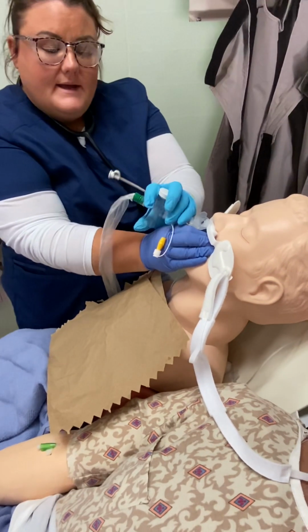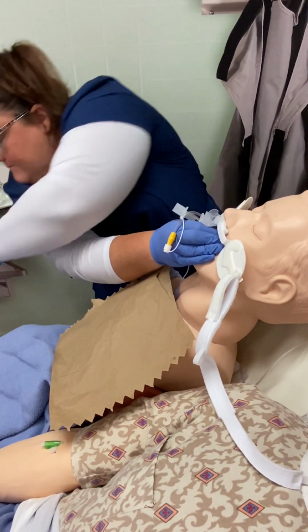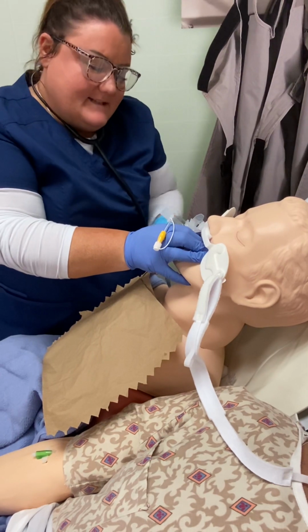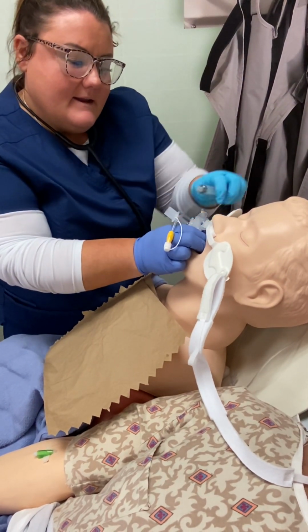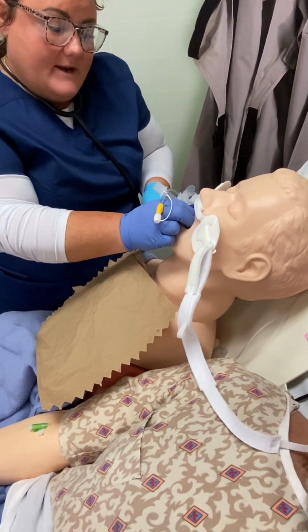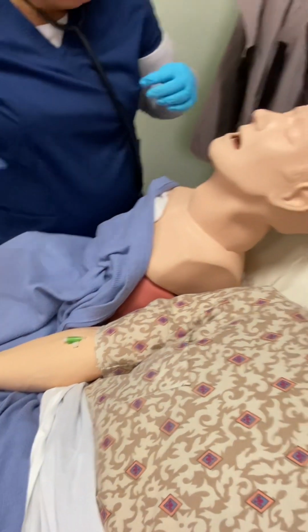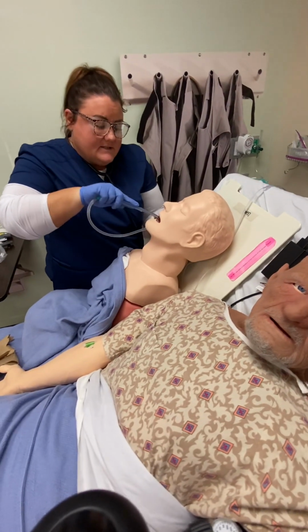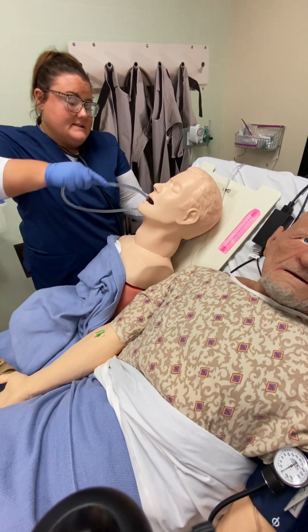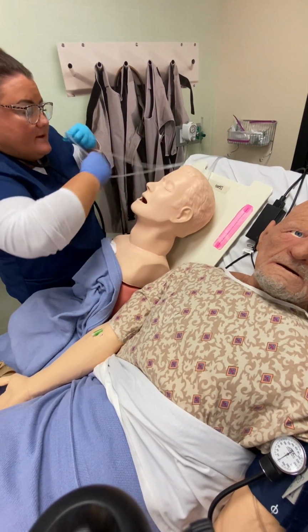All right, so now I'm gonna go ahead and take him off of the vent, put it in standby. Grab my syringe, okay? Go ahead and take that nice deep breath for me again. Okay, and at the end of his inspiration, I'm pulling out the air and cough, cough, cough. Great job. Go ahead and keep coughing. We're gonna suction his mouth out. Okay, making sure that we get everything deep in the back of the throat, the sides of the cheeks. Good job.